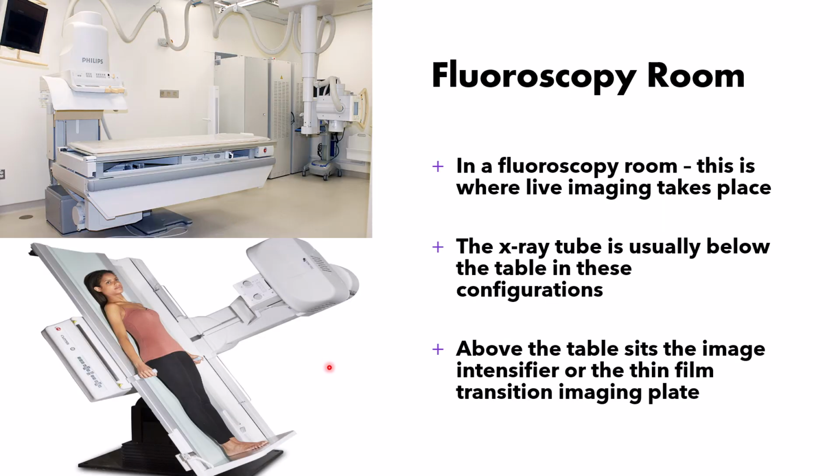Fluoroscopic room, we don't have a fluoroscopic unit. Those programs do not, but you'll see these in the hospital. Think of just the general x-ray as doing a photo, and this is doing a video or a movie. In this case, you have a table here, and you have your general x-ray tube. It's usually an R and F room, radiographic and fluoroscopic room. So you have the ability to do radiographs on this table, or to do a fluoroscopy.